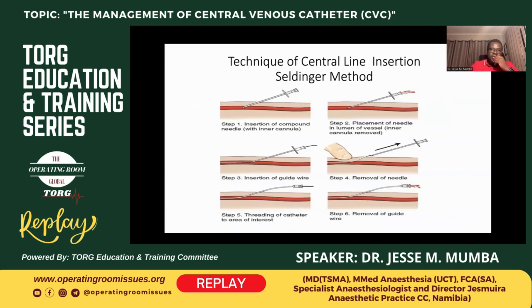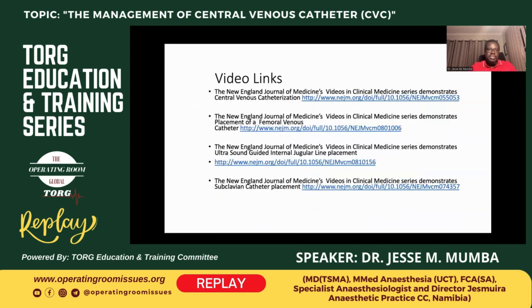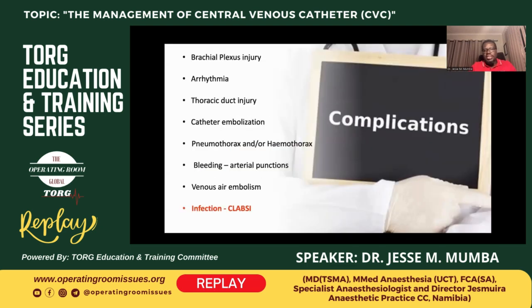The method of choice of insertion is the Seldinger method. This is simply a catheter over a guide wire, and it's been proven to be the safest way to do central venous access. I've also included some videos here. So when the talk is shared, you can click on these links to see how insertion of a central venous catheter is done. That said, this doesn't come without complications.